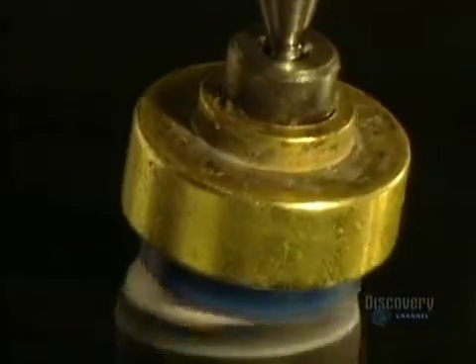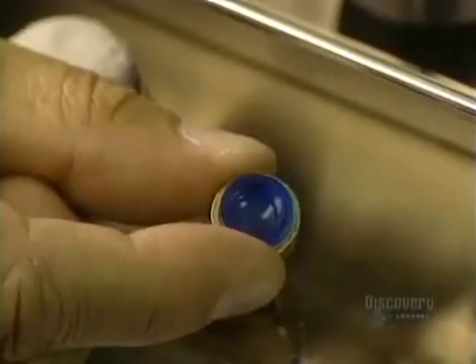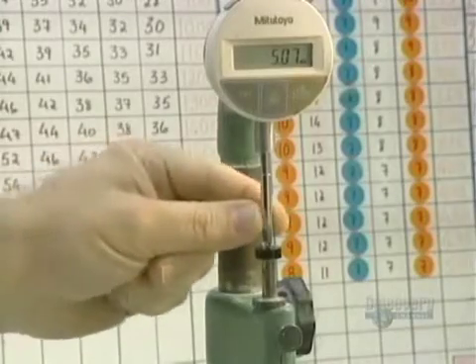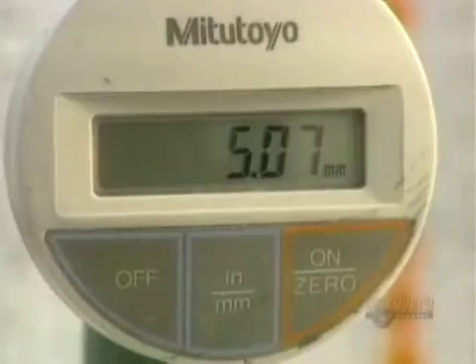Polishing is a crucial step because it assures excellent comfort and perfect vision. A technician measures lens thickness with an extremely precise gauge.